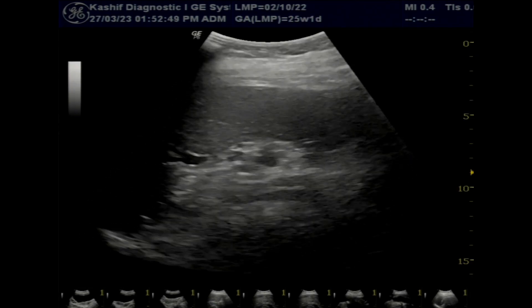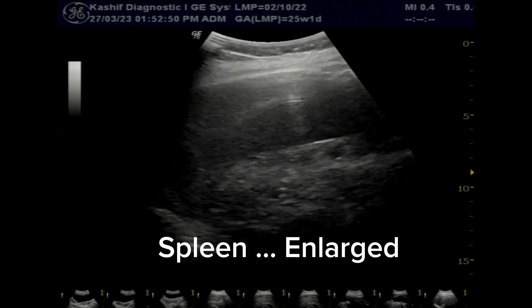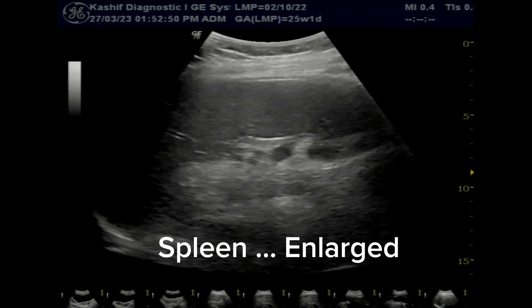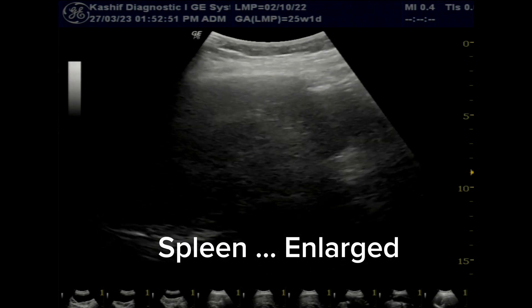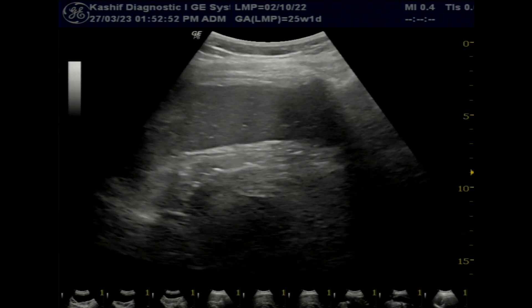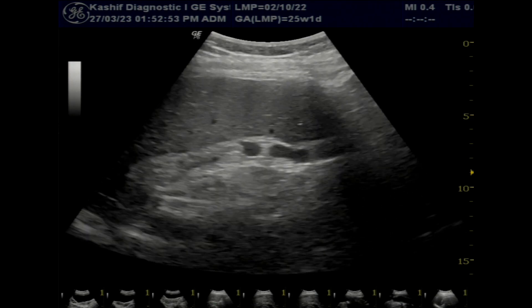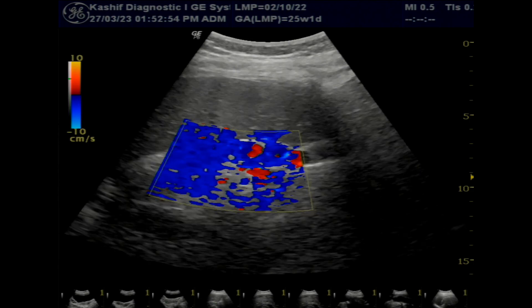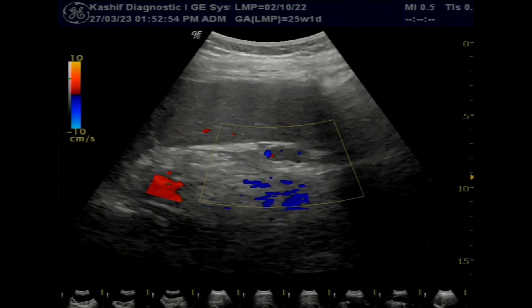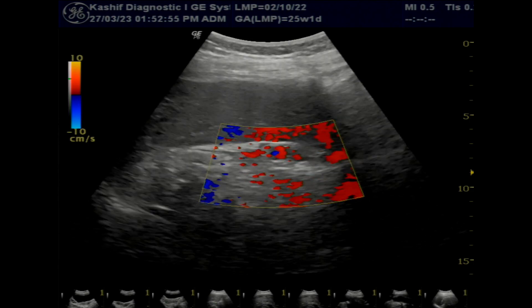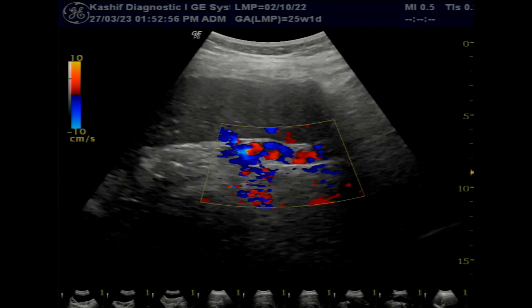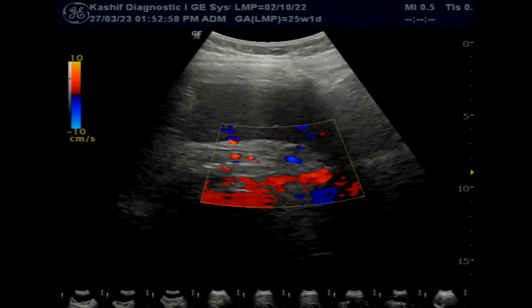The spleen is grossly enlarged at 16.6 centimeters. Note perisplenic collaterals, which are also a sign of portal hypertension.